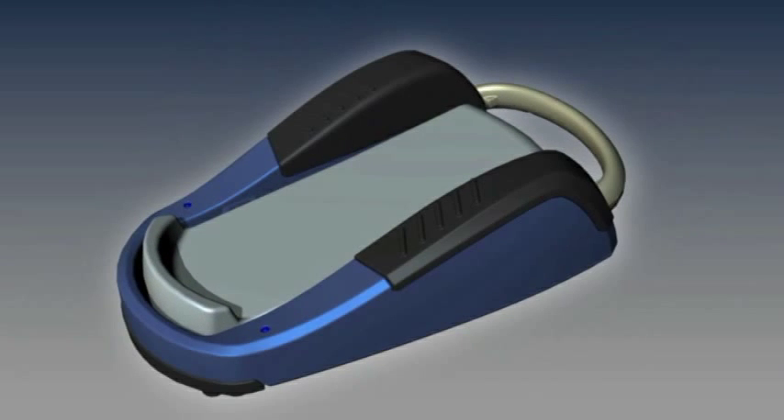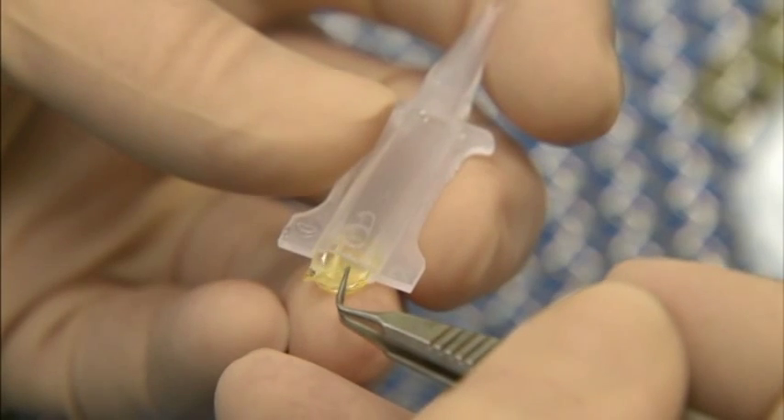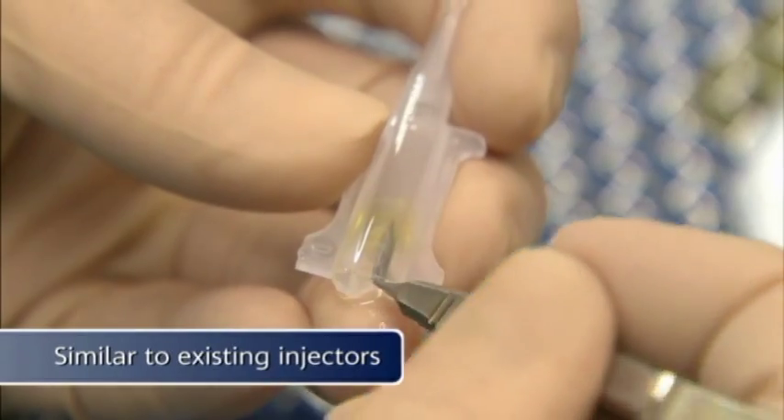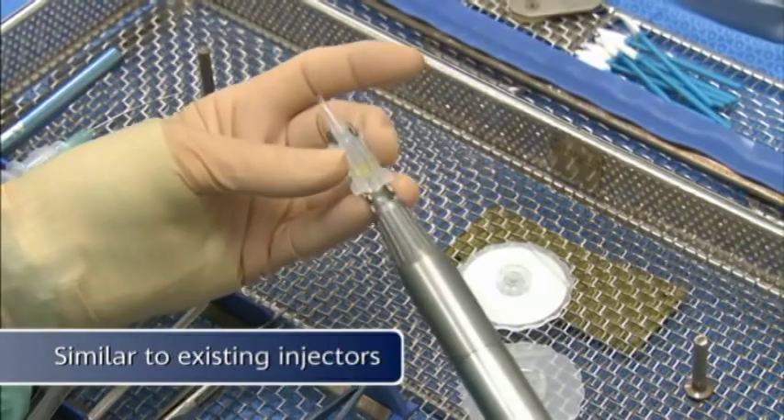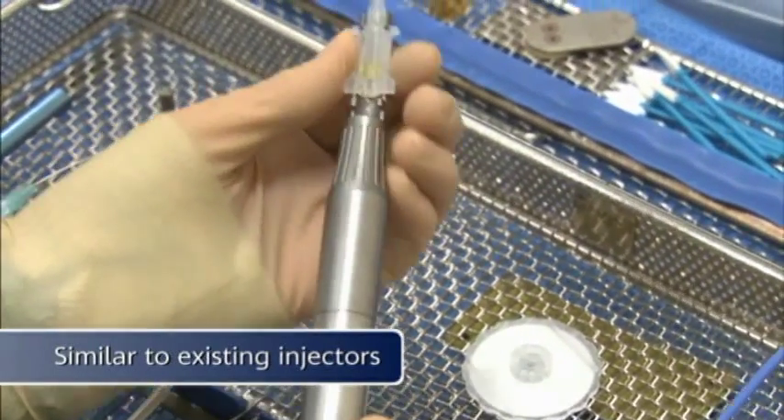Using the Infinity foot switch, AutoCert helps ensure that loading the IOL into the cartridge is similar to existing twist or syringe type injectors. Loading the cartridge into the handpiece also remains the same.